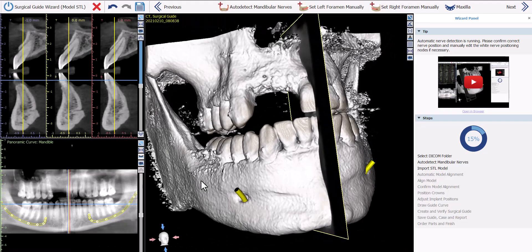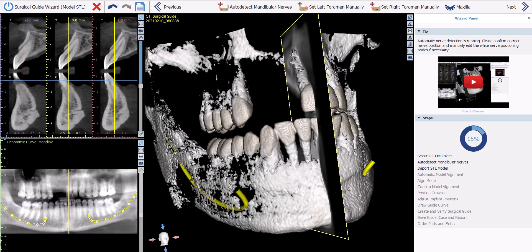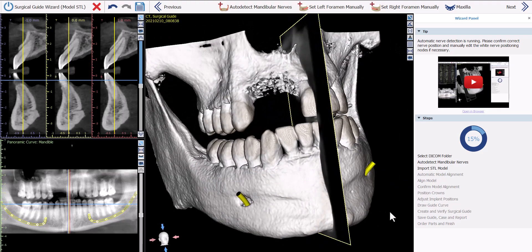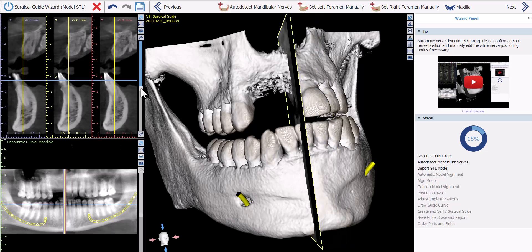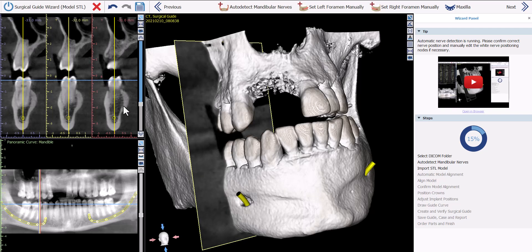The software has now run completely automatic nerve detection. We can see the nerves in the 2D views and in the 3D views. The wizard process flow works by automatically running the relevant process, showing it to the user to confirm and modify if needed, and then the user clicks Next to move on. We can confirm the nerve detection by grabbing and dragging nodes in any view, and navigate vertical slices using the vertical indicator in the 3D view.